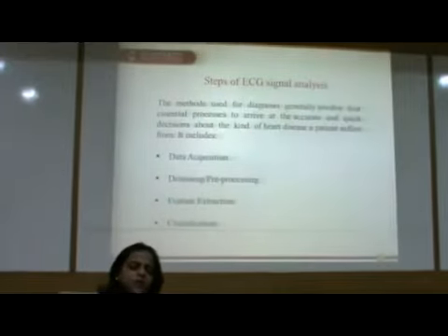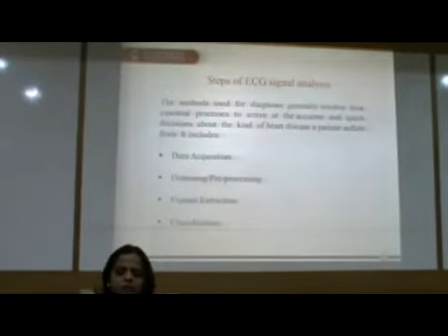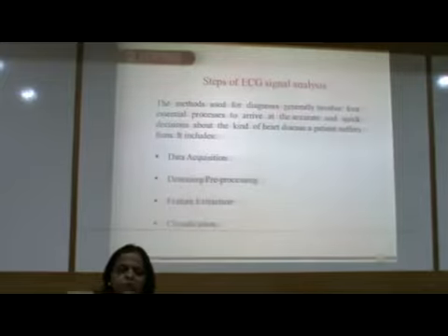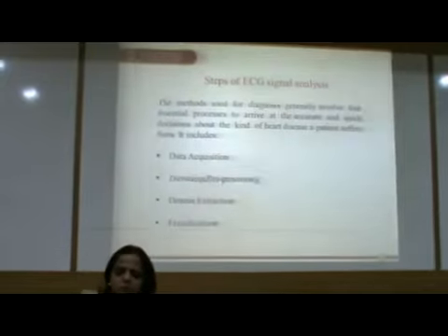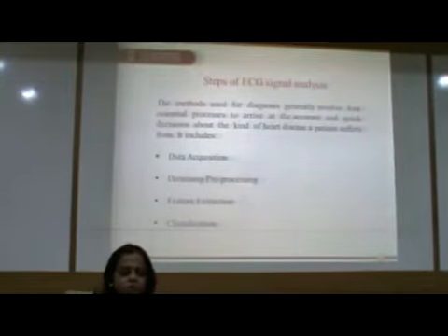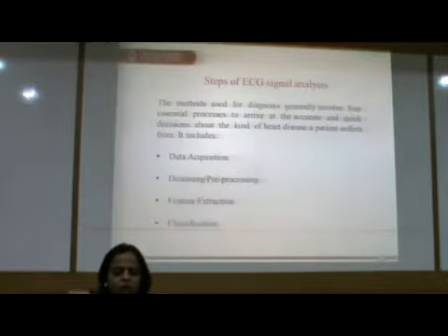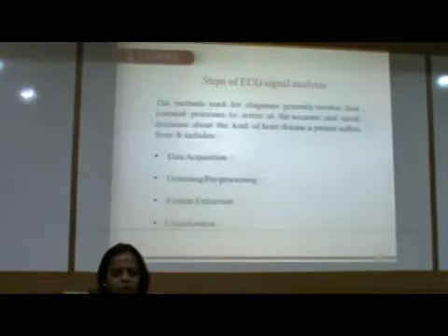These are the steps for ECG signal analysis, in which we analyze all these intervals, and feature extraction is there. The method used for diagnosis generally involves four essential processes to arrive at an accurate and quick decision about the kind of heart disease a patient suffers from.